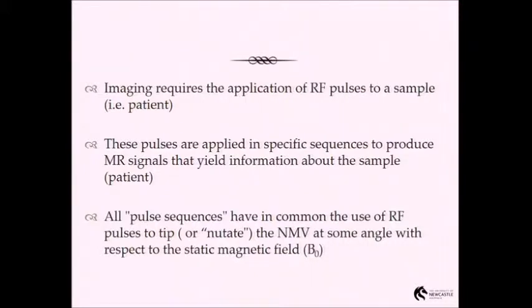You can excite one slice at a time, but to spatially encode that slice, it depends on the matrix. If the matrix is, let's say, a very simple matrix, 128, so you understand the concept of pixels and then voxels. You have a field of view divided into these lines, if you want to think about them as lines in one direction and lines in the other.